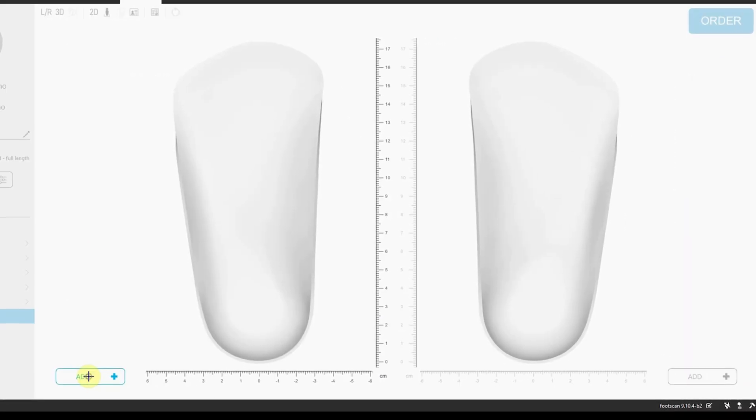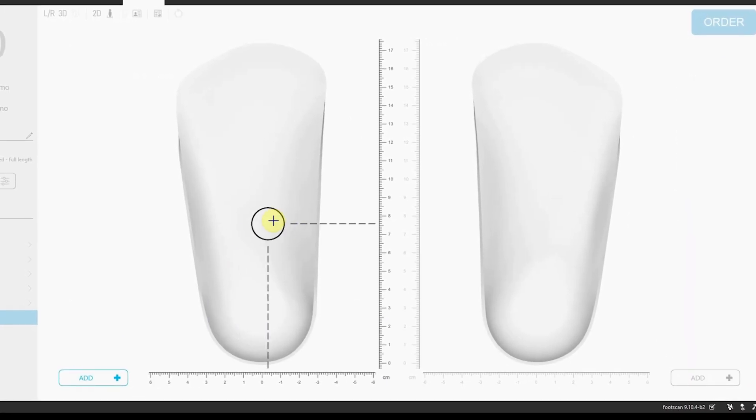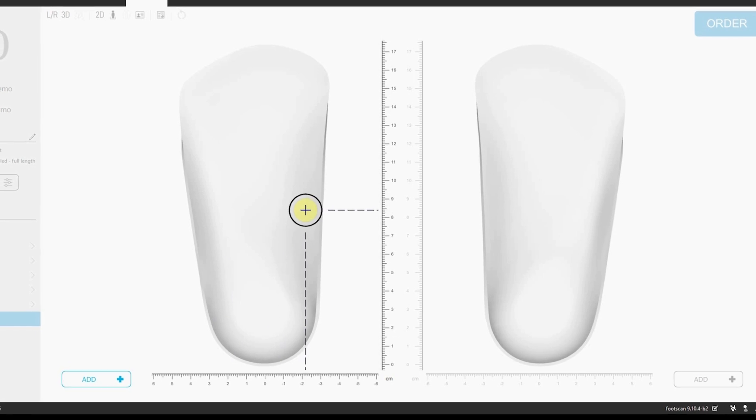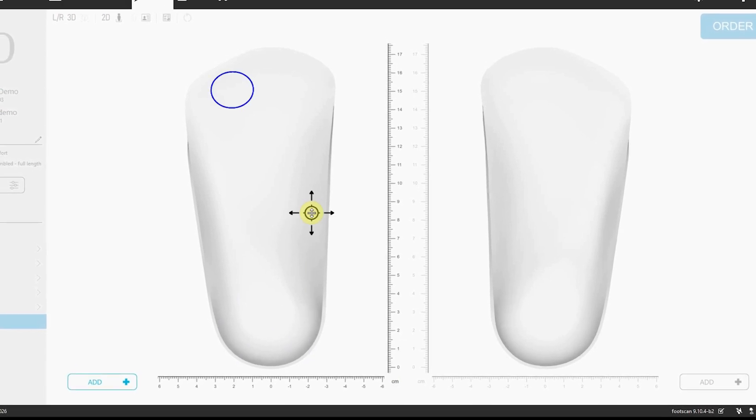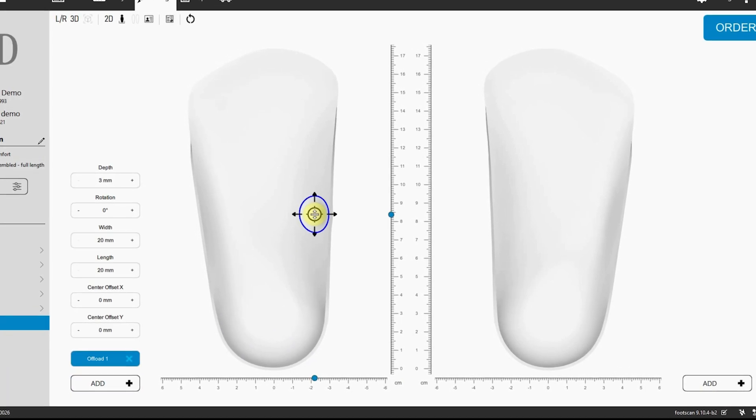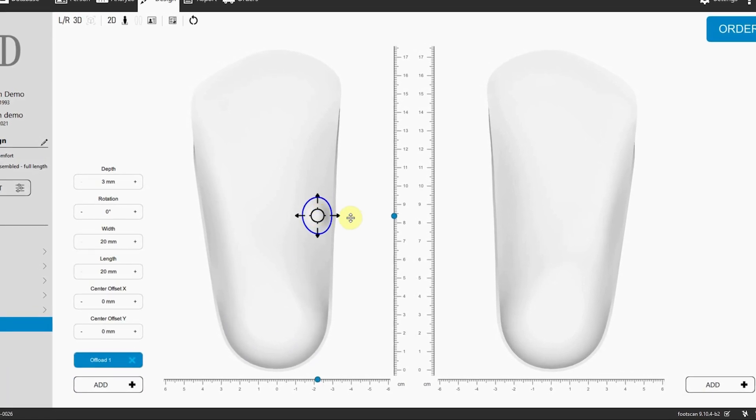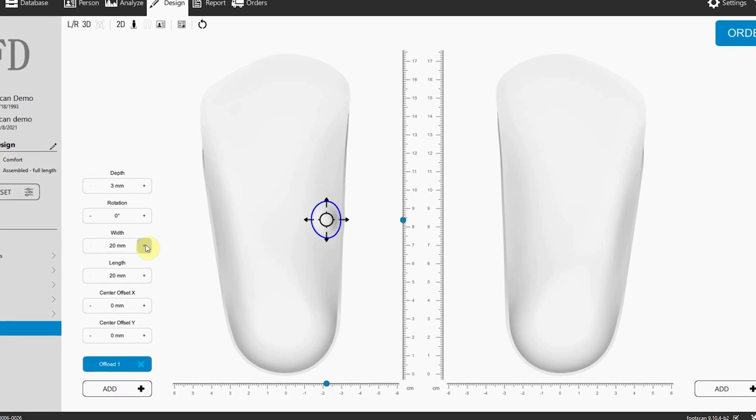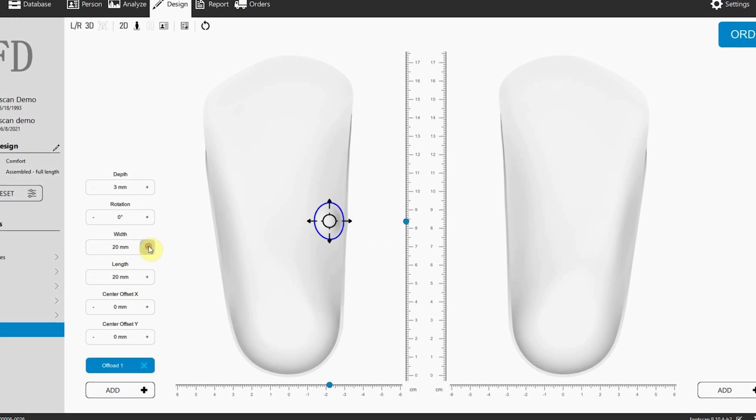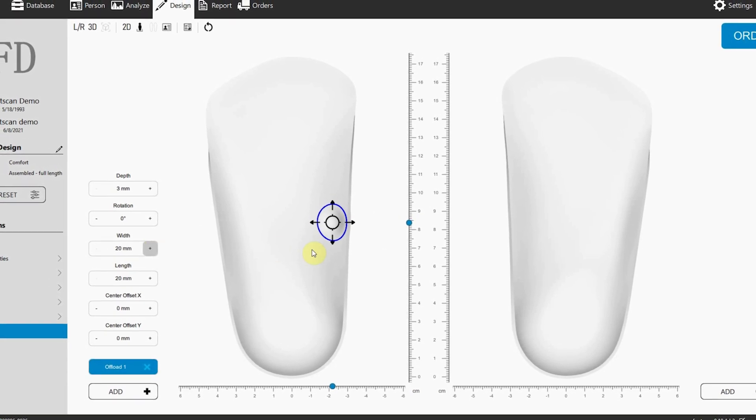Is your patient dealing with pain due to high pressure points? Do you want to offload a specific area of the foot? Our new offloading design feature allows you to relieve pressure exactly where it's needed, providing a more personalized approach to patient care.